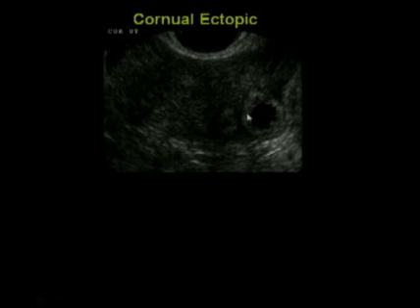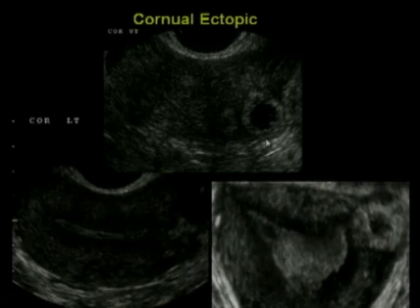Here's another cornual ectopic. This is in the left horn of the uterus, the left cornua of the uterus. Gestational sac, bright ring, no dark myometrium. It bulges the edge. Sometimes we can get a more clear-cut or definitive view using 3D, three-dimensional ultrasound, and here on the three-dimensional ultrasound, that's the fundus of the uterus. There's the left cornu or left horn of the uterus, and that's where the pregnancy is. It's not inside the body of the uterus. This is a cornual ectopic pregnancy that we were pretty sure of on the regular ultrasound and became completely sure on the 3D ultrasound.